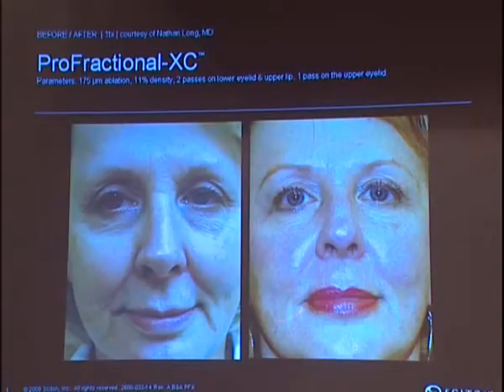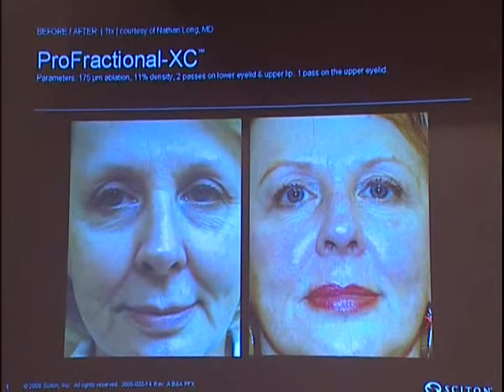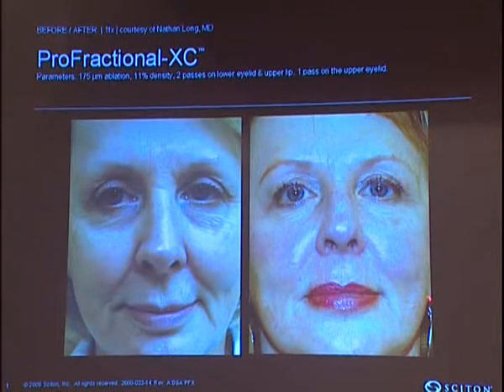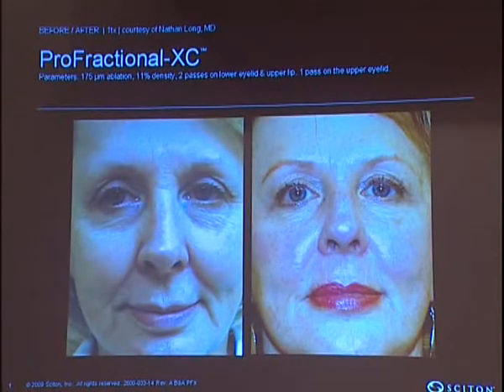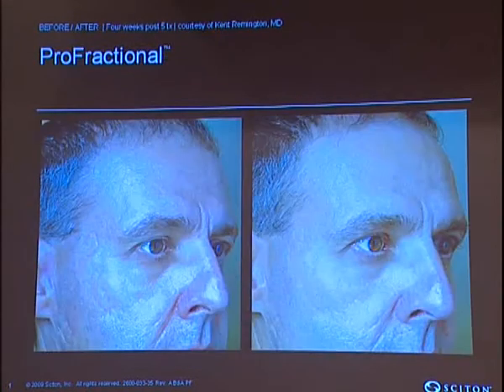We can see the improvement in the texture of the skin, lines. We can see here also the marionette lines. Also here the solar keratosis, scarring here.